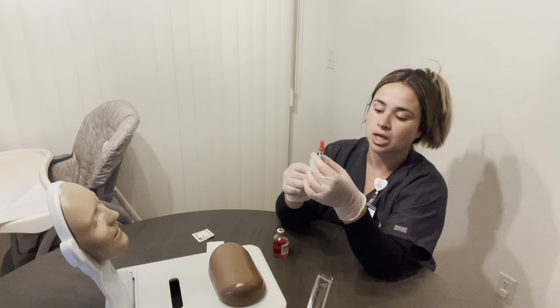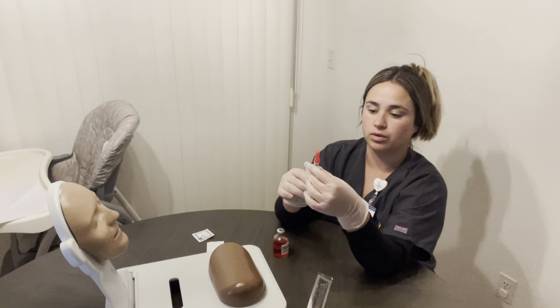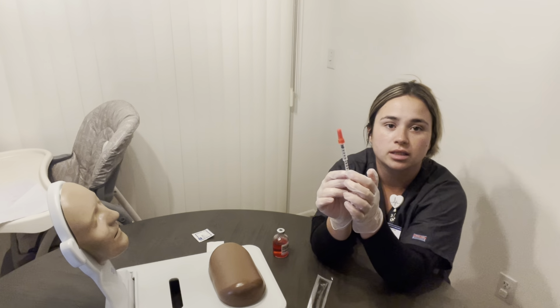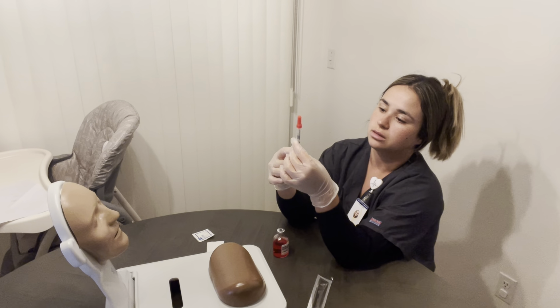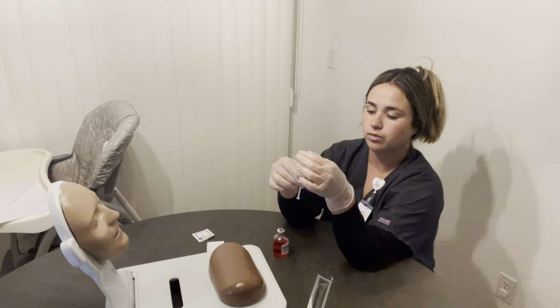that we're going to be doing. So since we're doing 1.5 milligrams, I would fill it up to that. Because I don't have the correct needle, it's not on here. This is measured in milliliters, so we're just going to pretend for right now, but that's what I would do. I'm just going to put in air to, let's just say 0.5. Okay, so hypothetically, 1.5 milligrams. So once we inject it with air, that's when we remove.